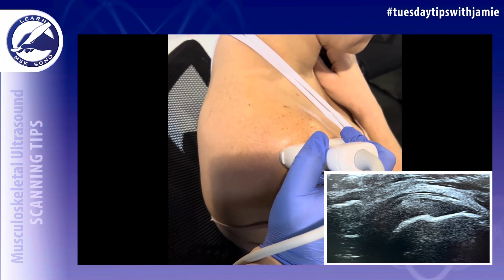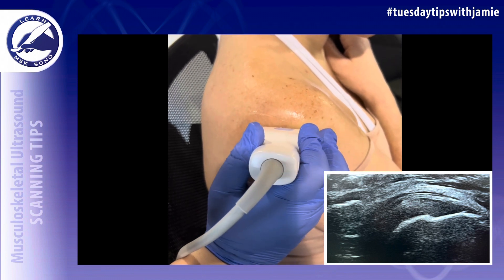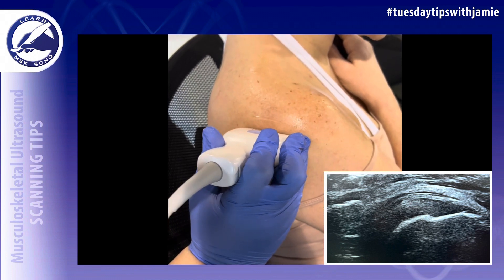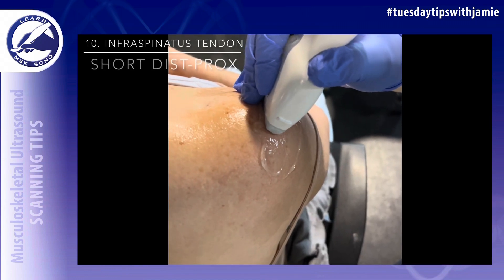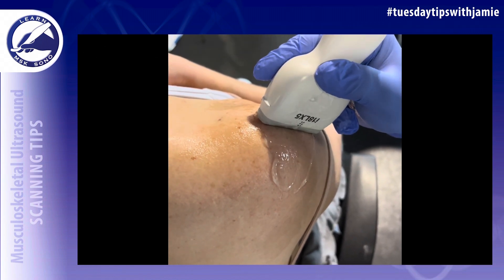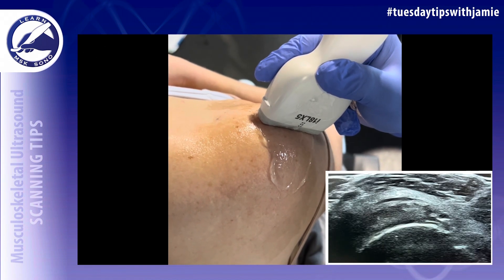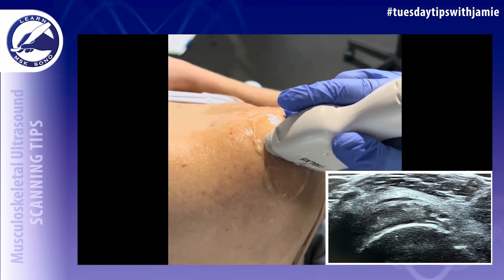Slide back a little bit, then down, and elongate the tendon over the glenohumeral joint as you go until you reach the myotendinous junction. Then rotate the transducer 90 degrees at the tendon insertion onto the greater tuberosity, and scan in the short axis from distal to proximal — from the insertion to the myotendinous junction.